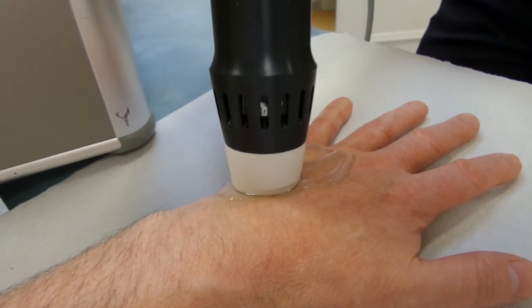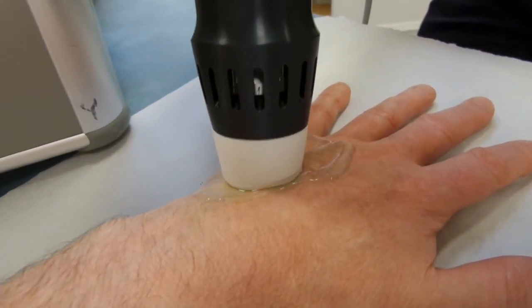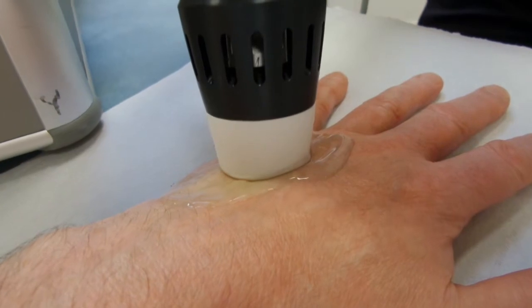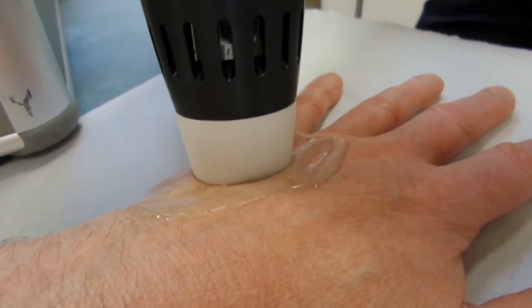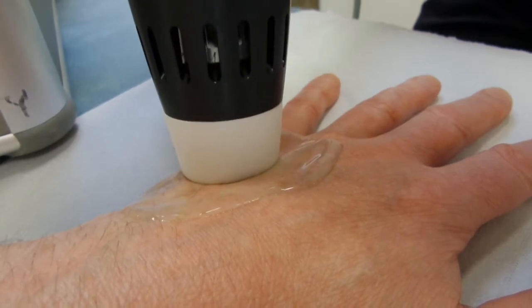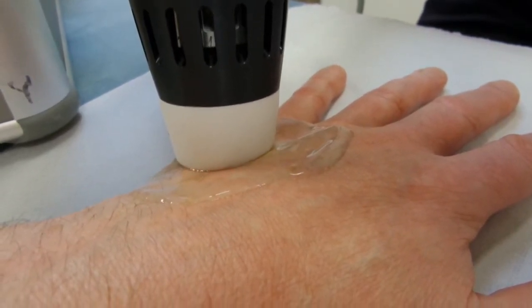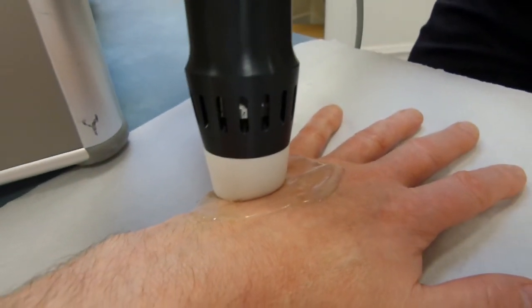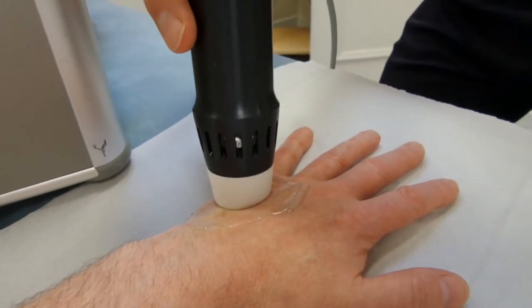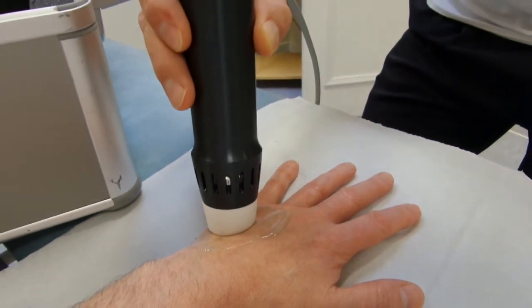We're moving our head around, just picking up gel and working around the problem area in the hand. We're looking for a change really in resonance. Move around the hand. A higher tinny sound is not the right area. A lower, deeper resonance sound is the correct area.